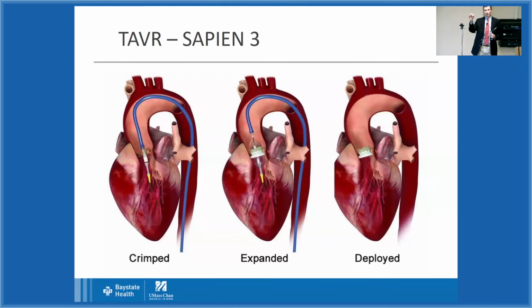what's left. Now this is a plastic model. I will warn you, it is a piece of injection molded plastic. It has seen better days. Try not to break it any more than I've already done, but that'll go around. And then I can hold the valve up here. This system really has a very simple control. The knob in my hand here just flexes the whole catheter to bend it around the aortic arch to position it in the heart. So that's that one. Let me unbend it.